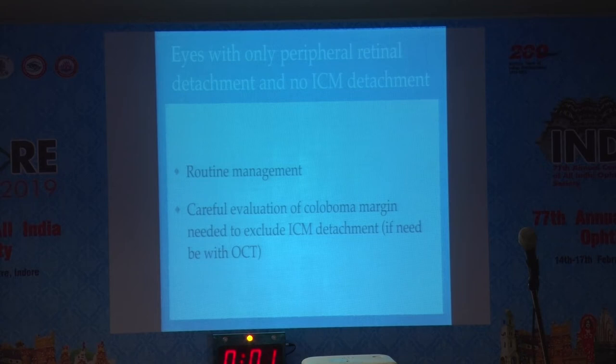But of course, there are selected cases like the case which you saw there, where the detachment is only restricted to one half of the retina. The rest of the coloboma margin theoretically can be left untreated. But when you are in, again, you tend to play safe and you treat.